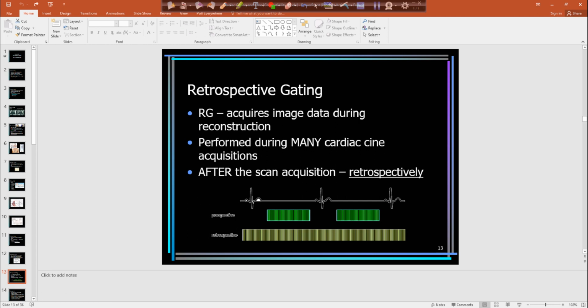the enterography exam. So they've changed the enterography exam. I was working with George down at Winship. They used to have some cine imaging to image the small bowel to evaluate Crohn's, and you could actually watch the contrast going through the valves. It's pretty cool. You see the bowel kind of contracting and relaxing. So they used to have the cine imaging of the bowel, but they've changed that. They don't do any more cine there, but they do cine imaging still of the heart, watch it contract and relax, watch the blood flow go throughout the heart.